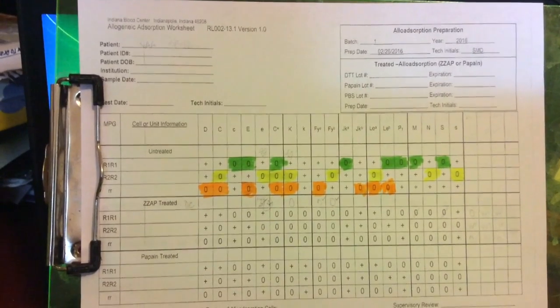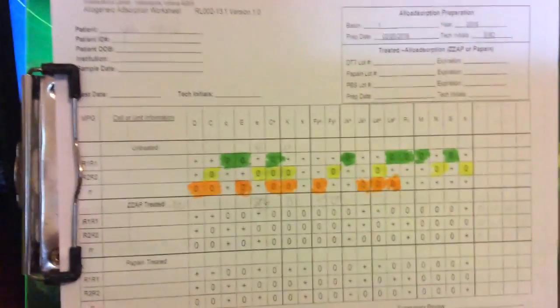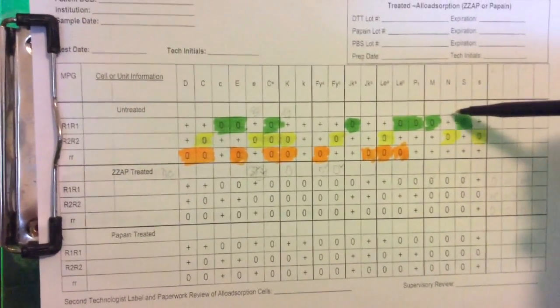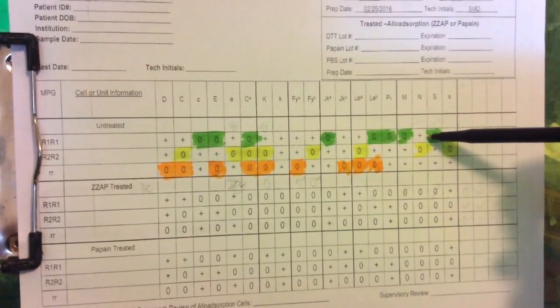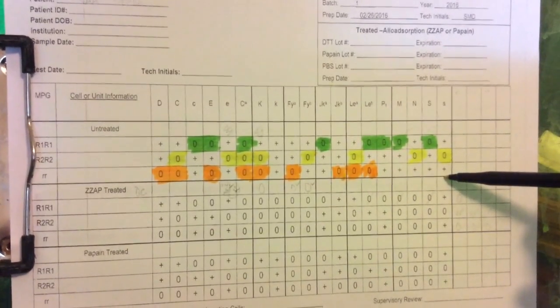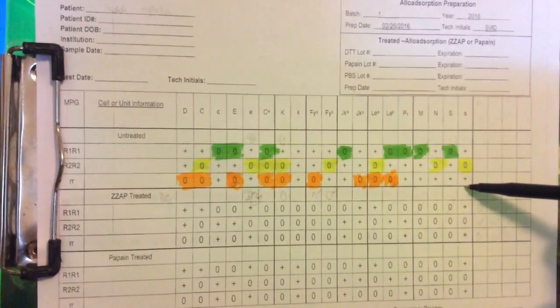What will be left in these serums are the negatives on each of the cells. What will be absorbed out are what are antigen positive. So what you're going to do is create a new rule out based on what will be left in each one of the serums, R1, R2, and little r. So this is one way to do it.